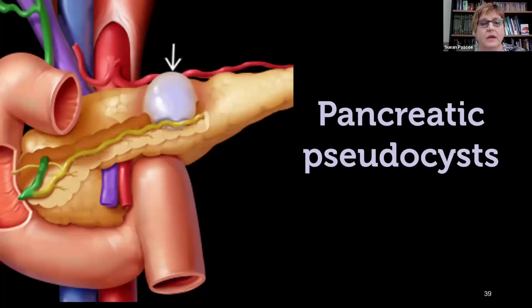The other thing that we can look at, and that was the inspiration for tonight's presentation, was pancreatic pseudocysts. I have to say, I've probably only seen maybe 3 or 4, and you don't wish bad pathology on anyone, but it's kind of like, wow, you see something really cool. Anyway, Brian has sent us a couple of pictures this week for a case that he saw, and I'll invite him in a minute to talk through the history.